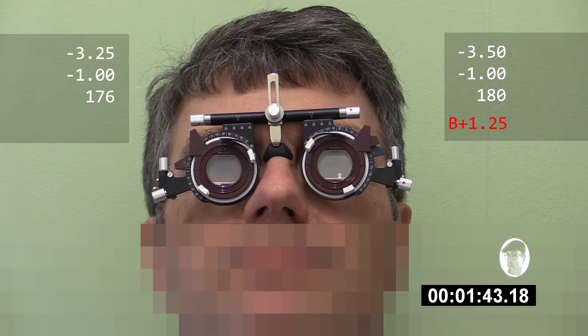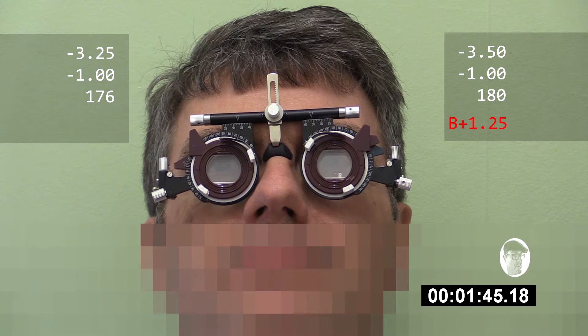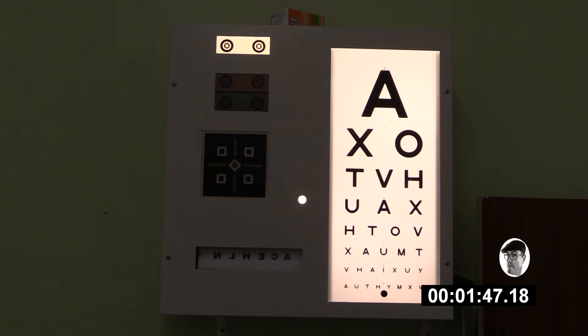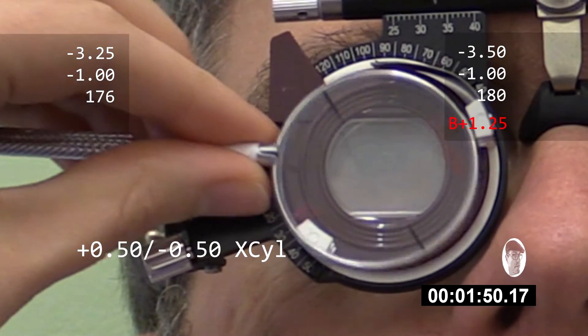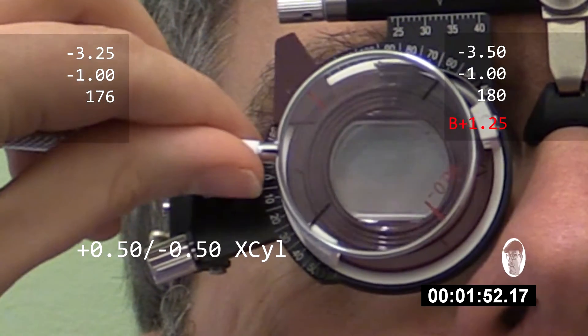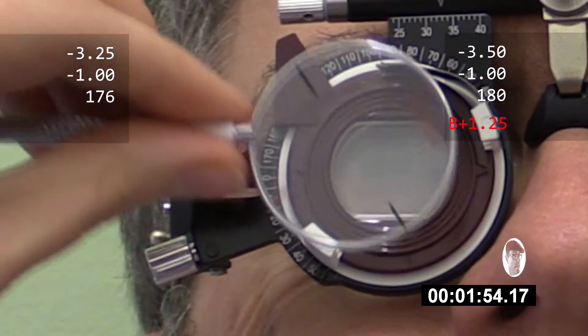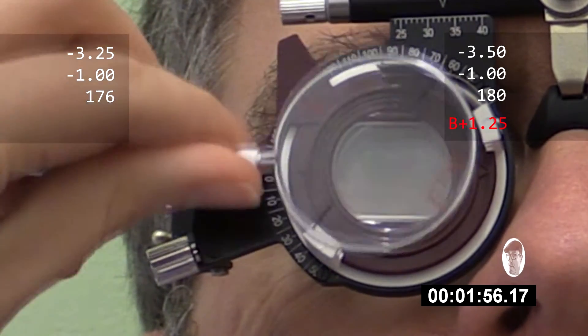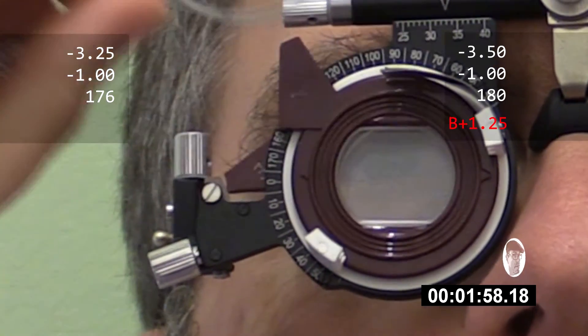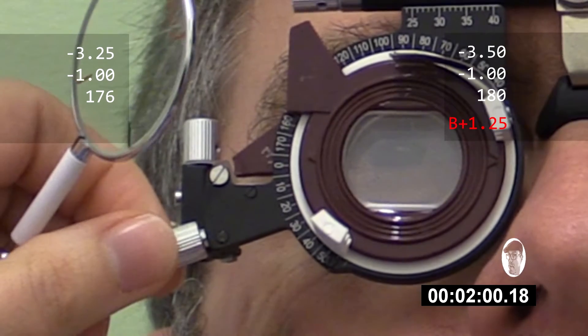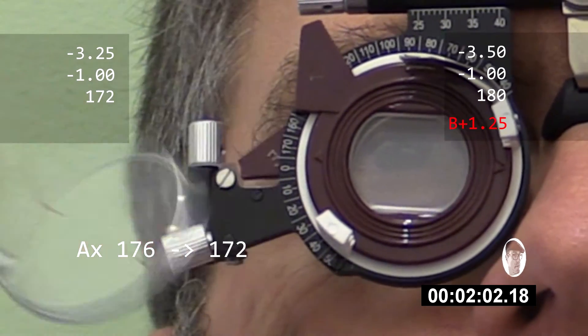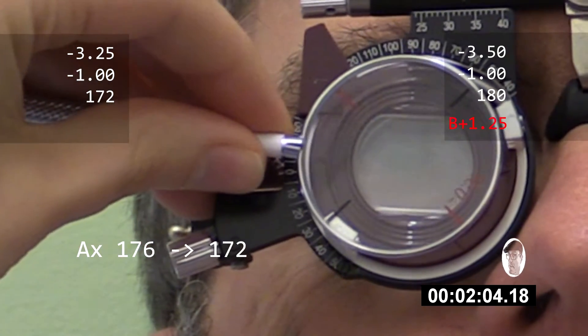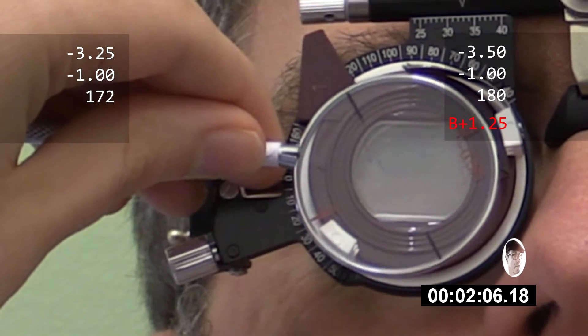Not much better there. Looking at the white background and the circles on it, are the circles rounder and clearer with one, or two, or about the same? So that's one, and that's two. Possibly two, but really not very much in it. Not much of a difference. Well, a little bit there.